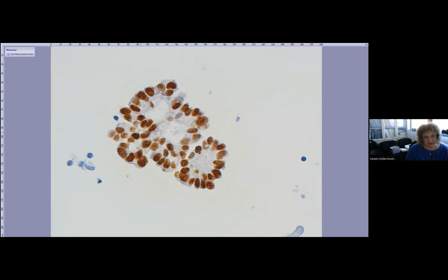It is not often, really, I have to admit, but in a large screening lab, you can expect it a few times in one year that we pick up something like this. We have about 35,000 pap smears in one year, so it is really totally rare. But we are always excited when we pick up something like this and suggest to check the ovaries.